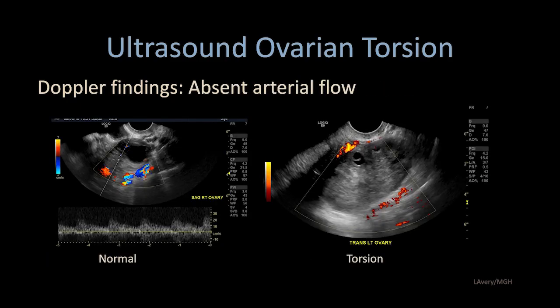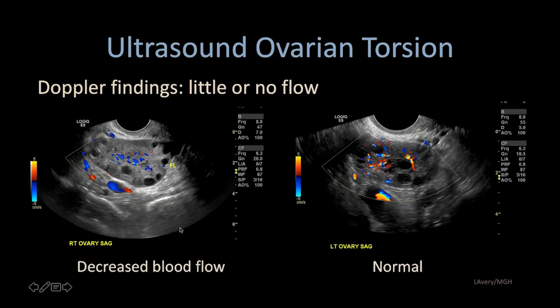Although frequently there may be absent flow — as in this case showing no blood flow compared to the contralateral normal side with its normal low-resistant waveform — there are also instances where there may be just less blood flow. In this ovary we see decreased blood flow with peripheral follicles and heterogeneous central stroma, compared to the normal side where there is avid, multidirectional blood flow.